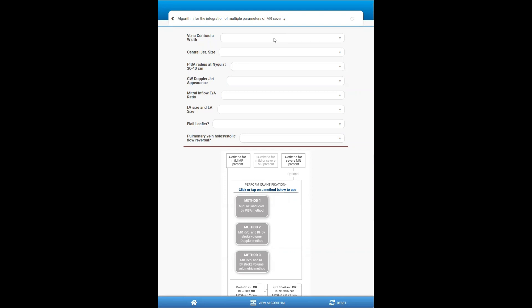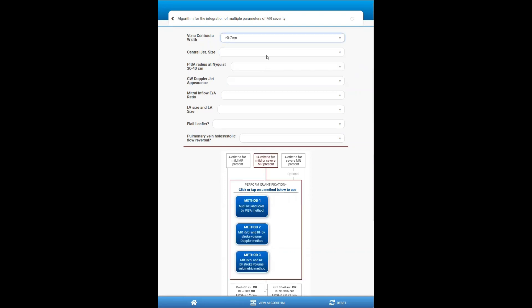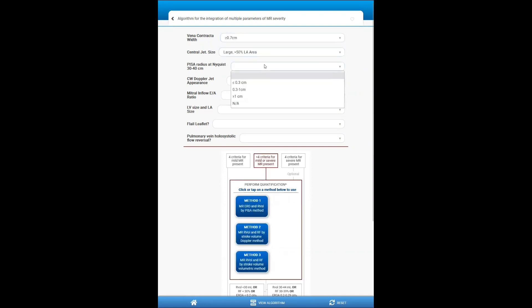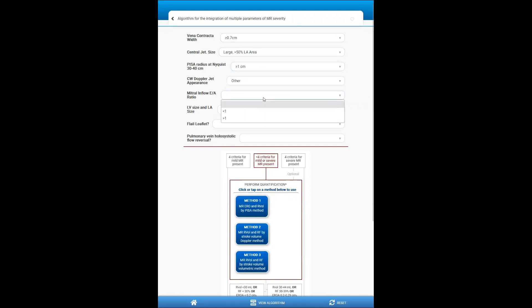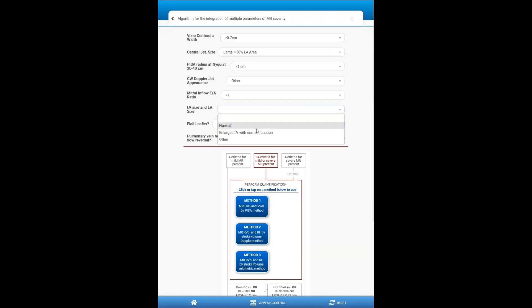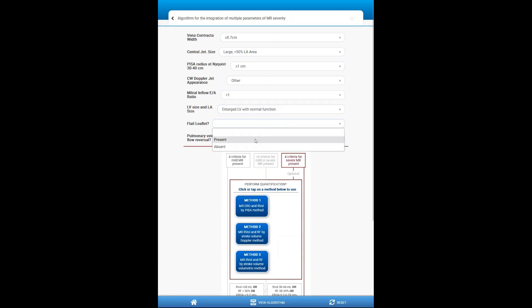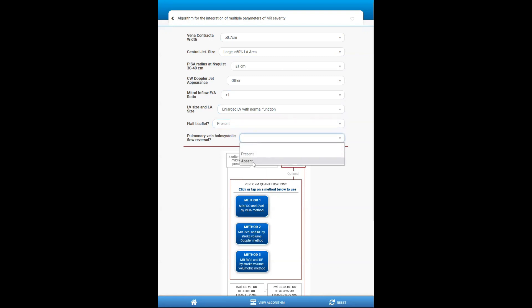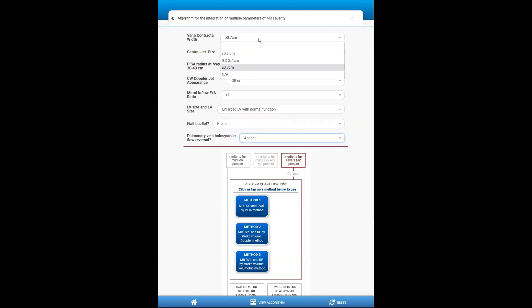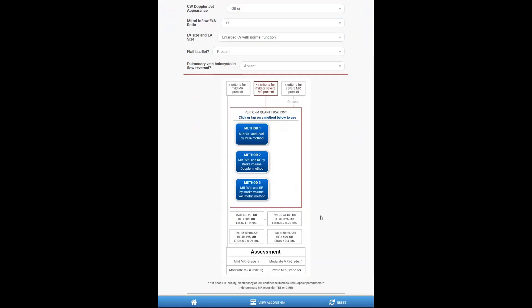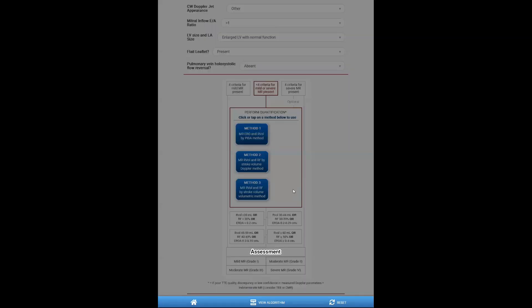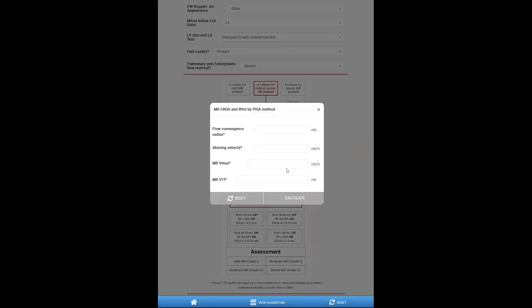So let me enter a few parameters that, let's say, are abnormal. And see, notice I've reached four parameters for severe MR. What if I enter parameters that do not meet these criteria? The guideline will load the different methods that we can use for this. So let me click on the PISA method. That immediately takes me to the PISA calculator.